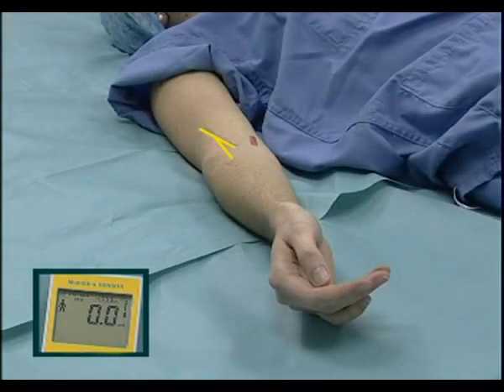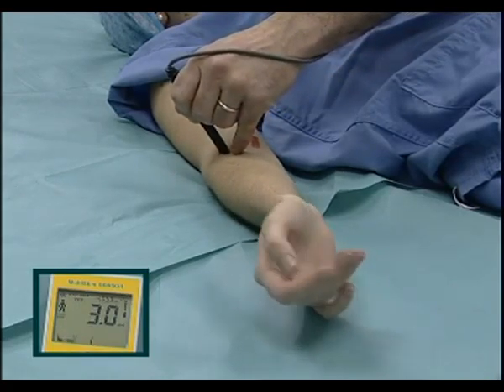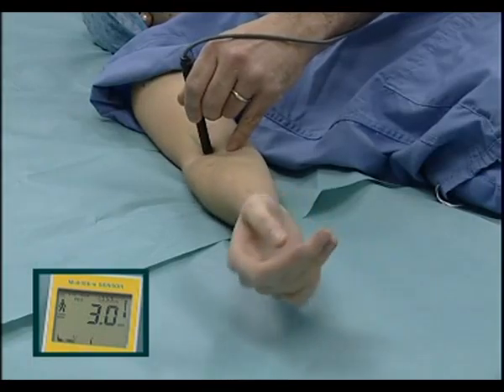Radial nerve. At the elbow, it lies in the groove between brachioradialis muscle and biceps tendon, proximal to the flexor crease. Paresthesia can occur into the dorsum of the hand. Motor response elicits mainly wrist and thumb extension.